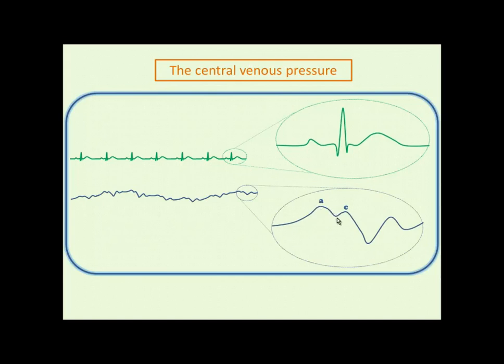So end diastole is actually this little valley here, and we call that the Z point, or for my friends in the True North Strong and Free, we would call this the Z point, and this is end diastole. So this is actually here your end diastolic filling pressure. This is really the true filling pressure of the heart that you want to know, again, at end expiration.